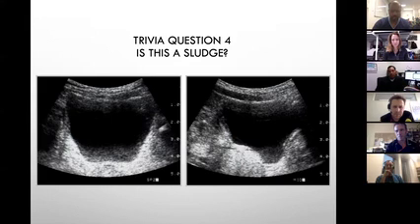Something easier, a solid proof you can't argue with. Color Doppler? Nope. Something easier than that, Sam. You don't have to think too much. Would you flush the catheter? You're going invasive; think non-invasive techniques. Move the patient. Yeah, move the patient and see if it moves.